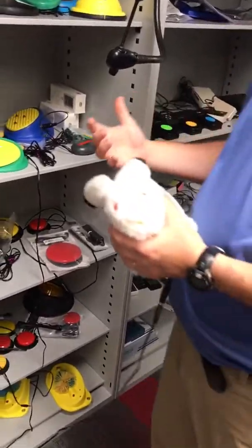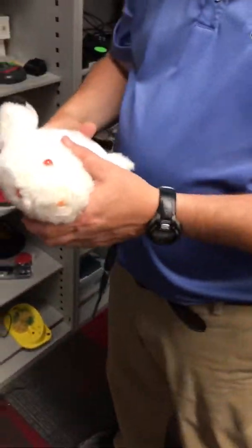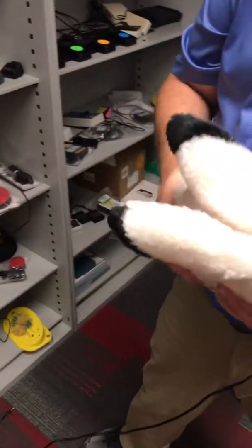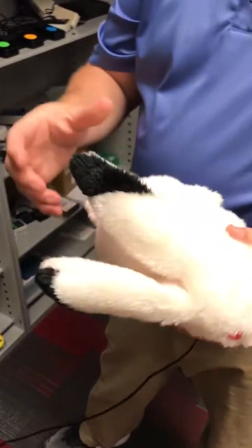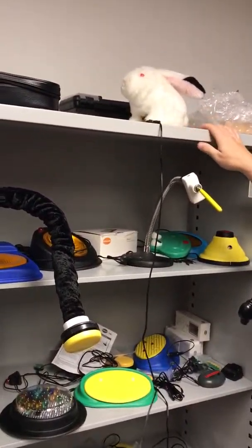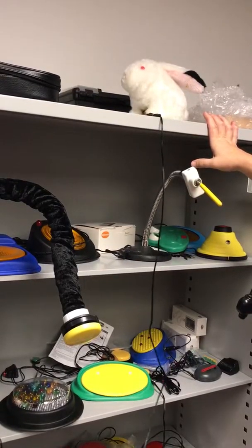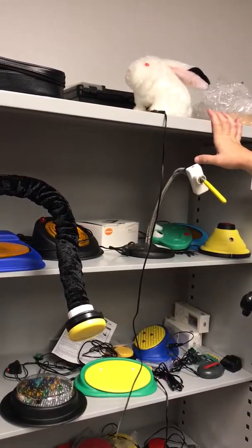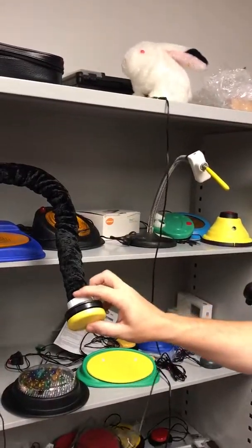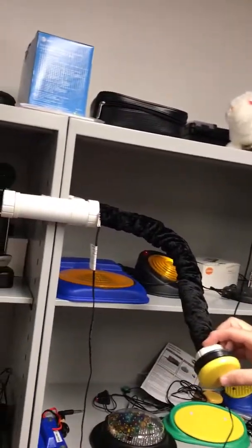Actually, this toy was made for kids with disabilities. But you can modify a lot of toys and things like that, even if the person may not have the ability to make it do what it's supposed to do. What is it supposed to do? Well, it's supposed to hop around, and this one does. Just hop around? Right, but a lot of people can't turn things on or turn the volume up and down because it's just physically hard to interact with the device. But you can hook it up to something like a switch.